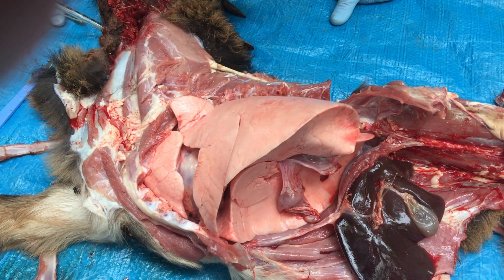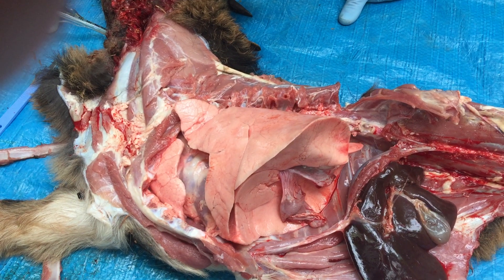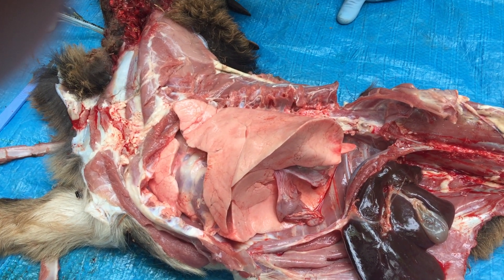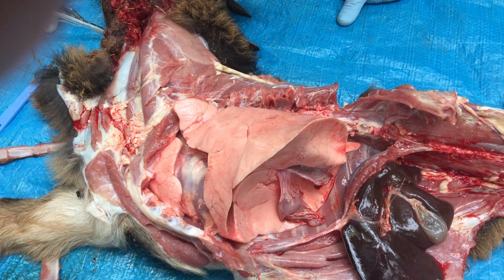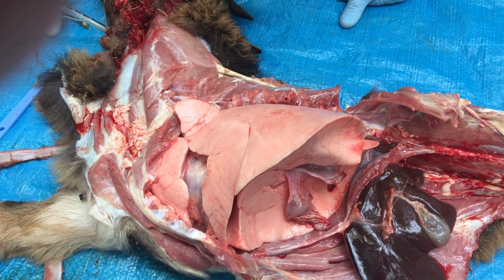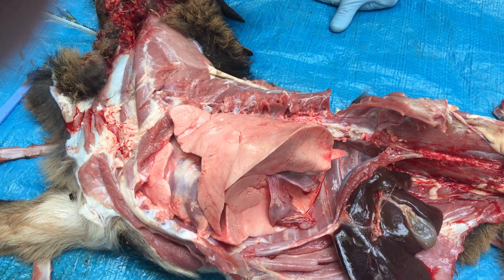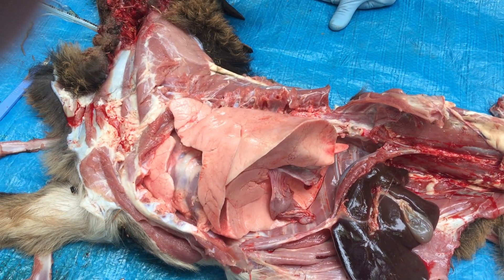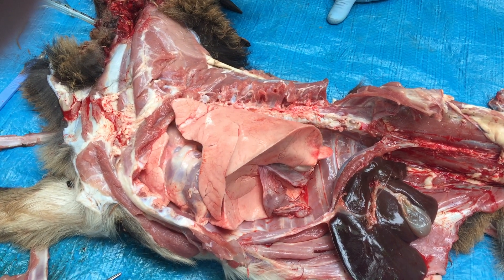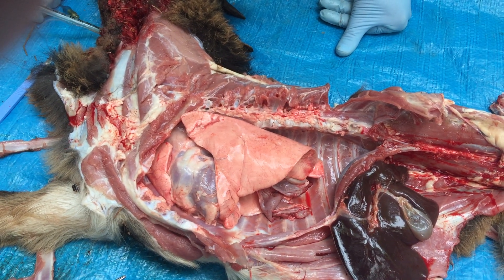Especially within a fixed space with a rib cage around it. So now let's go back to normo ventilation at a reasonable rate. Right, significantly different. So I'll take that PEEP off again — there you go, it's right down. Look at that — it just disappears. It's quite incredible.